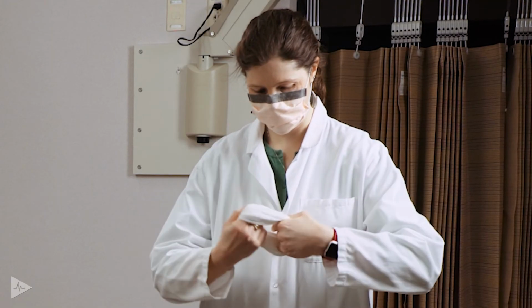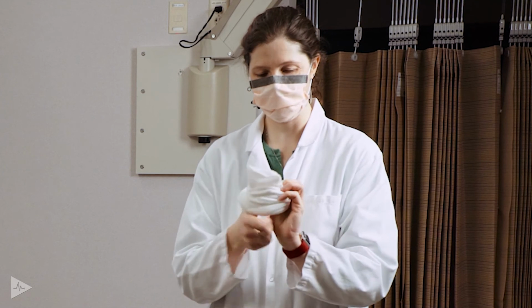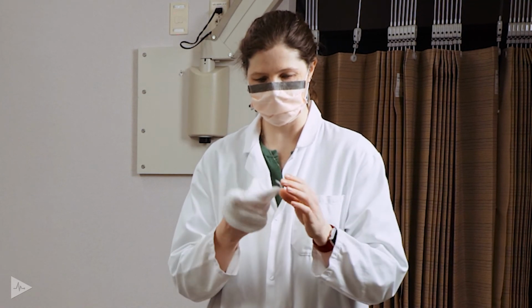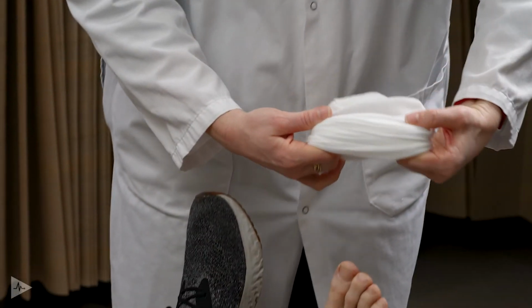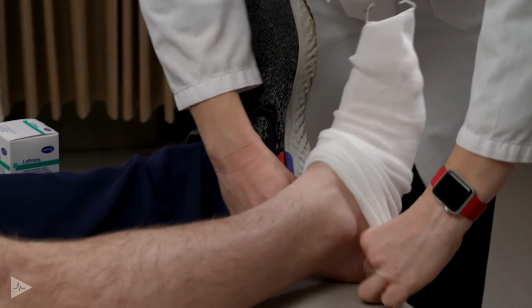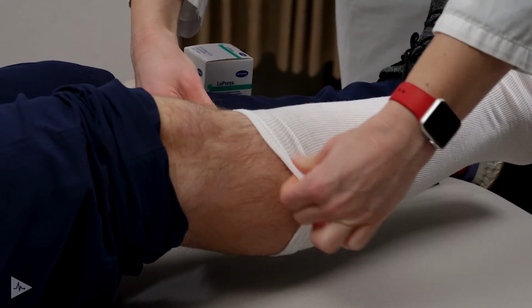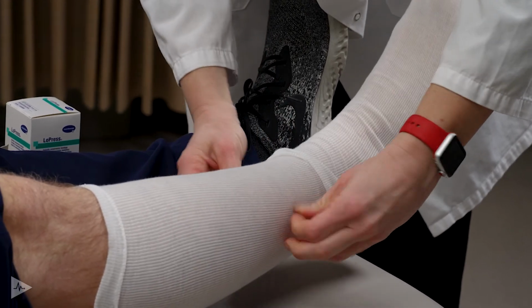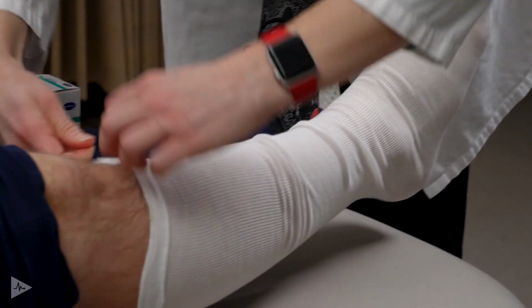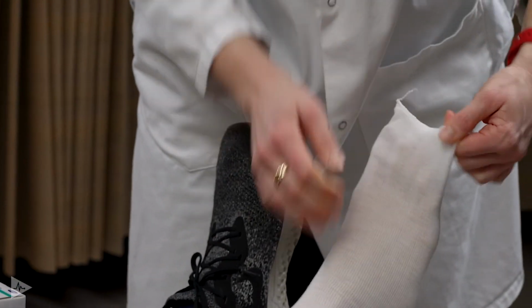Depending on the patient's comorbidities, we may look to flip this inside out if we're using a stocking like this, to avoid any rubbing of the seam on the toes and cause any skin irritation that way. So this will just be applied like a regular sock. This is just a basic white liner sock. There's no compression in this sock. Again, you want to just try to make sure you get any kind of wrinkles out. Keep that loose around the toes.